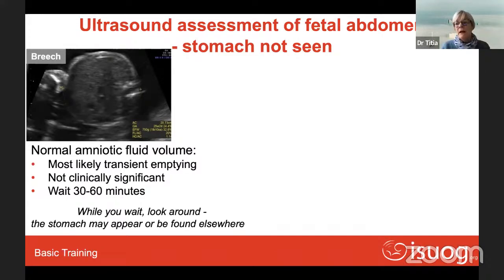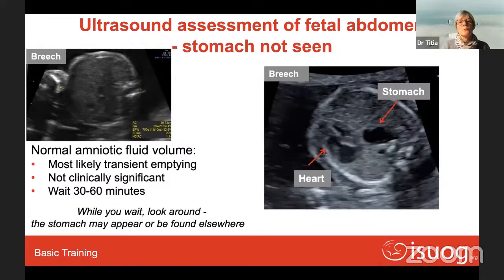And it's nice to look at the beginning of your scan also to determine the situs, because then you still have the whole scan to wait for the stomach to fill, and you can do all the other things and then move back to the abdomen and see, oh, the stomach is filled. Well, so there's no problem at all, or it hasn't filled, and then maybe you are dealing with a problem.